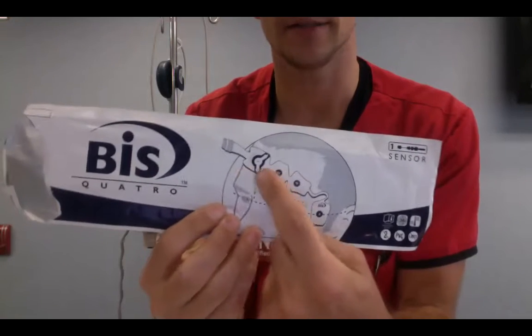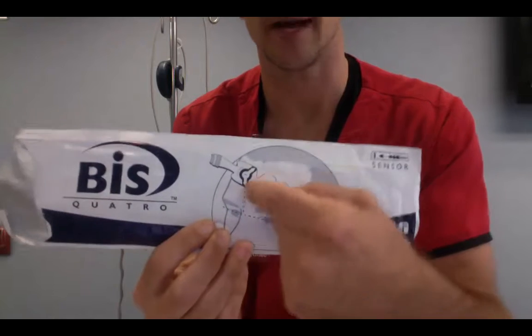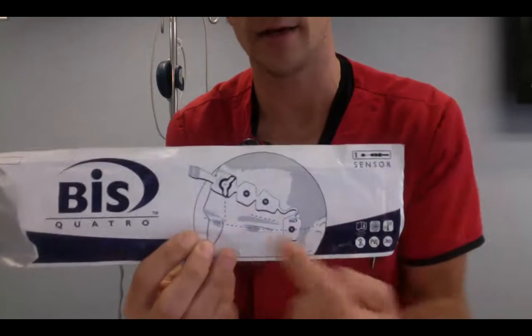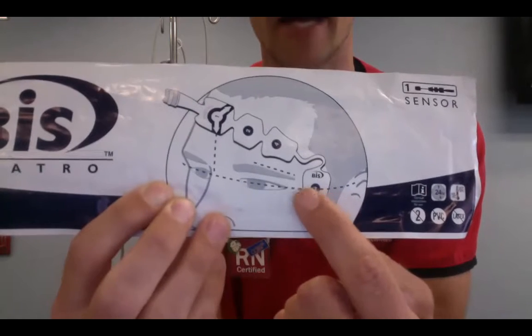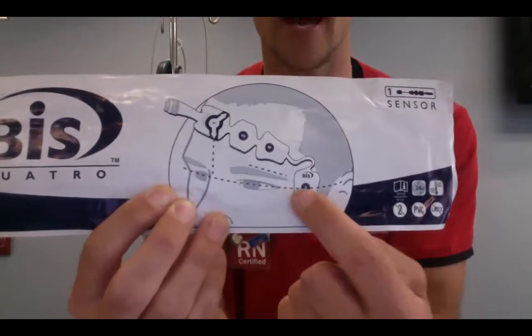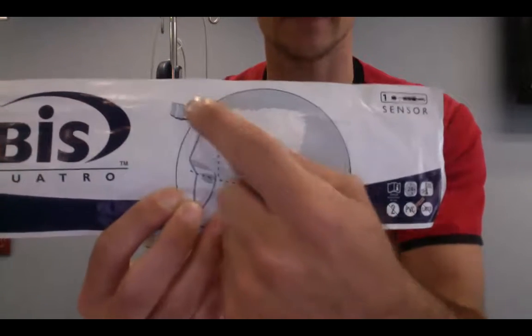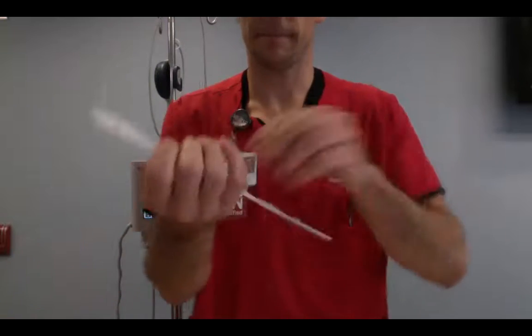We see correct placement on the front at the top of the forehead, 2 inches from the bridge of the nose in the center with the arrow pointing directly down. And we see number 3 here right in line with the outer canthus of the eye. And then this is going in a downward diagonal angle. So let's pull it out of the packaging and we'll place it on.